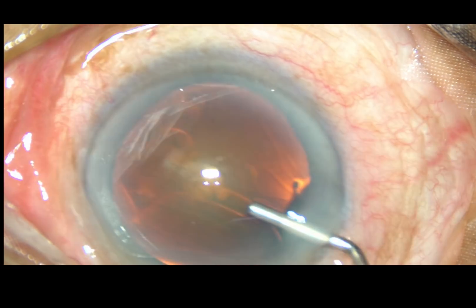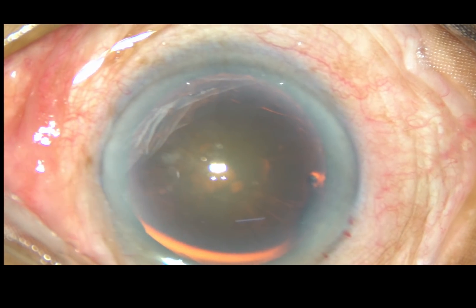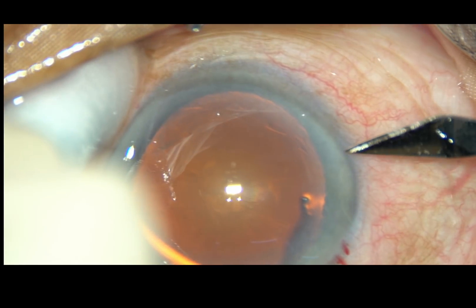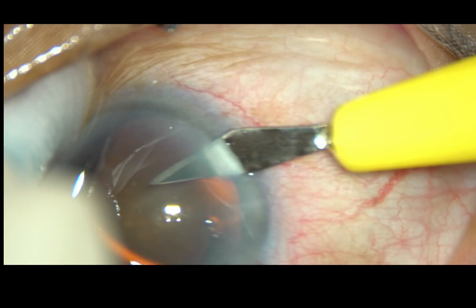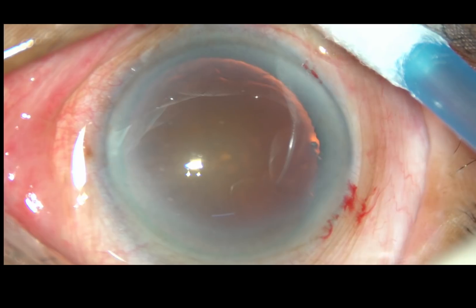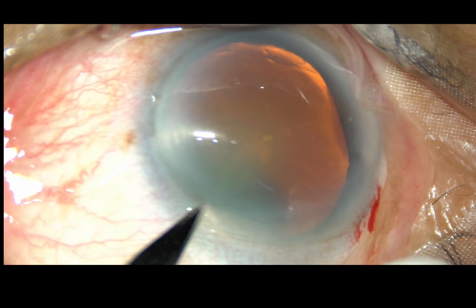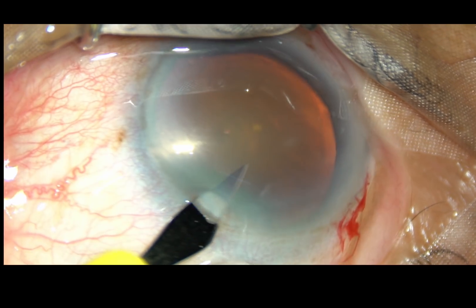I did a very small rhexis in this case, about 4 mm in diameter. Even then, I had to tear the zonular fibers all around. This is the first case I am seeing in my practice with so much anterior insertion of the zonular fibers.